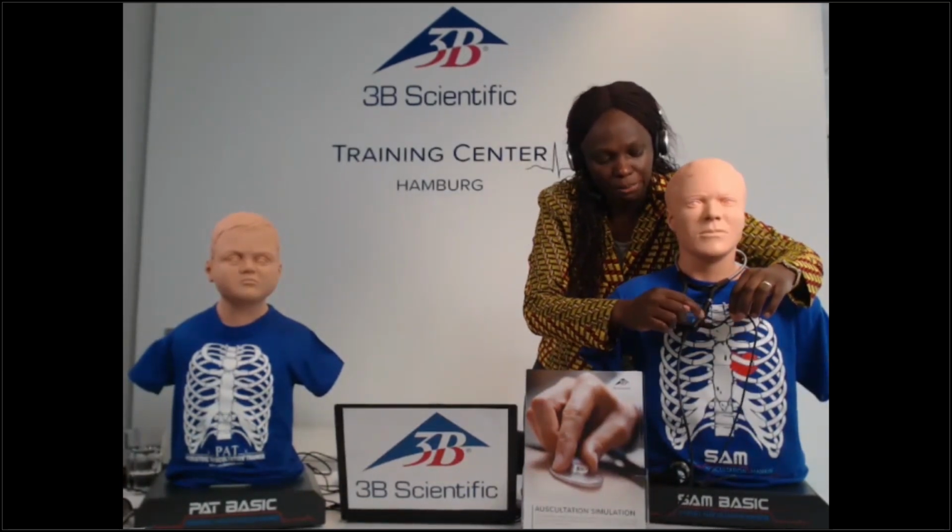So what I'm going to do now, I'm going to show you the software. I'll share my screen with you, because as it is now, you cannot see the sounds. Everything is in the system already. And as I mentioned before, using this USB cable, you put it at the side of the port here, and then you connect it to your laptop, as I have already done. I did this already with the SAM. So the software that you're going to look at is the software for the SAM Basic. I have connected it already, as you can see here. So the port is connected and it is connected to my laptop.